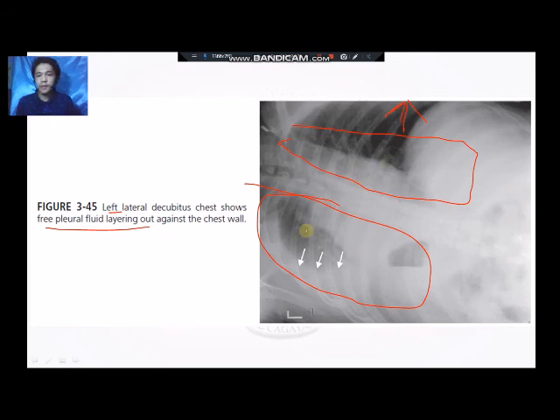Okay? So again, kung kinsa to nga side ang affected kang patient, then that's the side that will be placed closer towards the bed. Dito siya nga side maghigda. Okay. Kung right side ang affected, then have the patient assume the right lateral recumbent. Kung naa sa left side ni patient na problem, then have the patient assume the left lateral recumbent nga position and then do a decubitus nga projection.